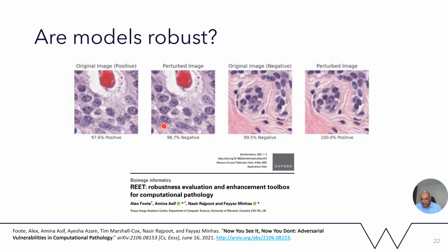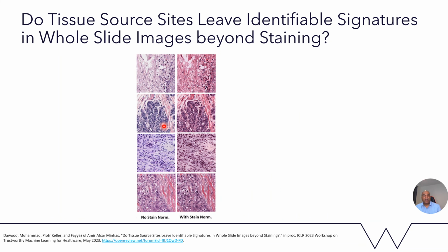But the conclusion is, unless we train these methods to be robust, they are not robust by themselves to such variations. With the development of foundation models, I must say that, due to unsupervised training, the effect of such robustness issues has diminished, but we still need to test how robust these machine learning methods are to such variations.